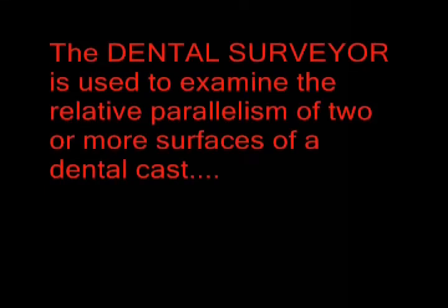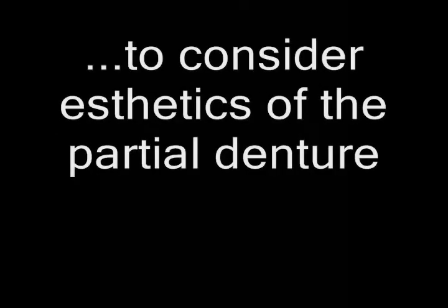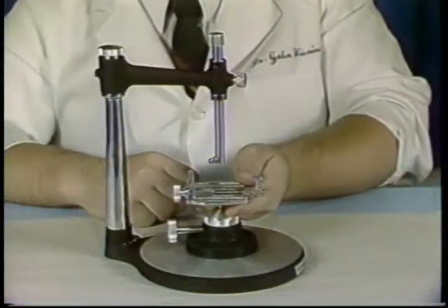The dental surveyor is a paralleling device which has many uses in dentistry. The purpose of surveying the diagnostic cast is to locate surfaces that can function as guiding planes, to locate areas which may be used for retention of the partial denture, to locate interferences to the path of insertion, and to maximize the aesthetics of the partial denture.